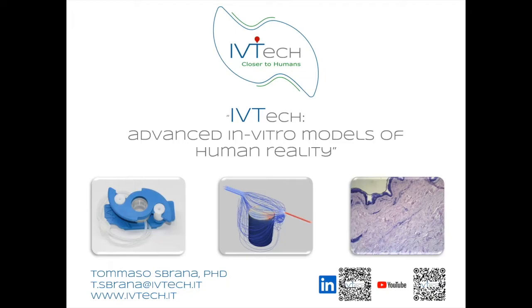I also saw, Tommaso, that you can use the chamber for multi-organ testing. How many organs can you test in a row? Well, the connection of different chambers in series increases the complexity of the in vitro model. We are able to connect up to 10 chambers, but currently our clients have reached up to 4 chambers, so 4 different tissues connected in series.